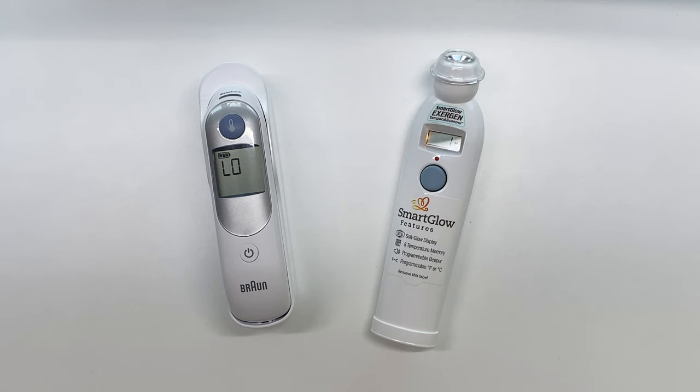However, these two were highly accurate as well as highly consistent within readings. If I took a temperature five times they pretty much came up about point one or point two degrees off of each other after each reading.